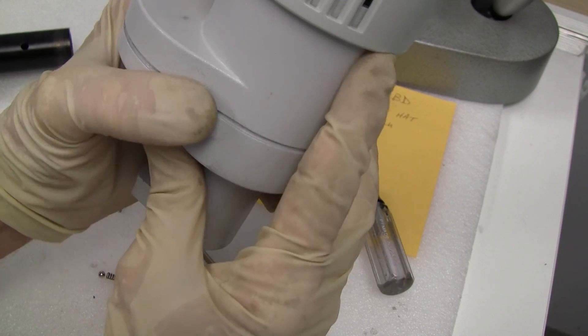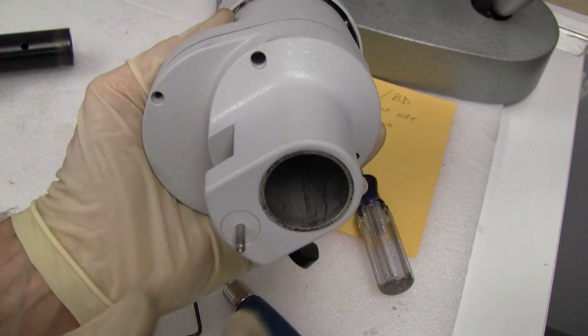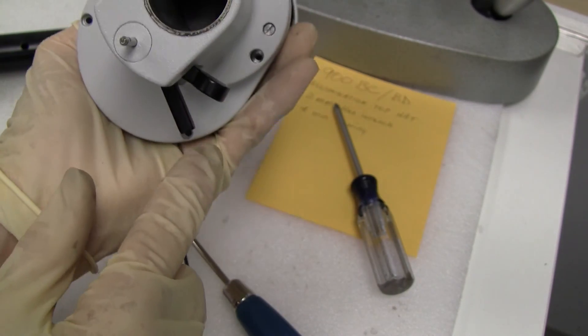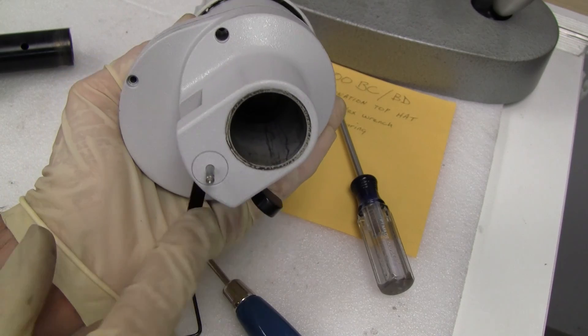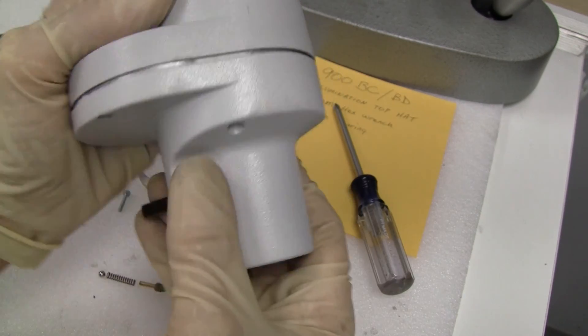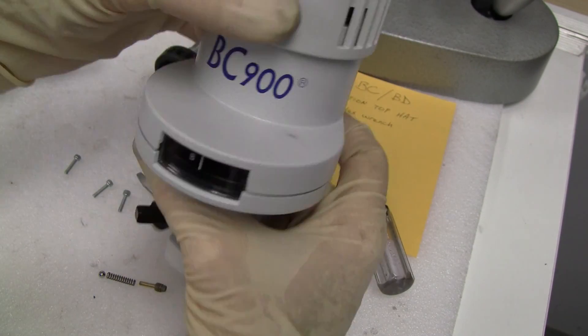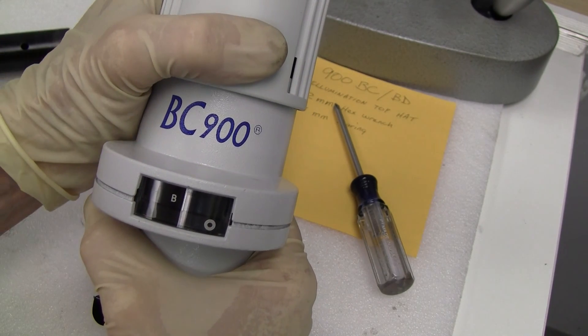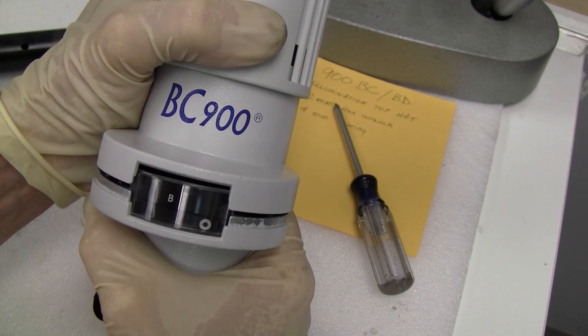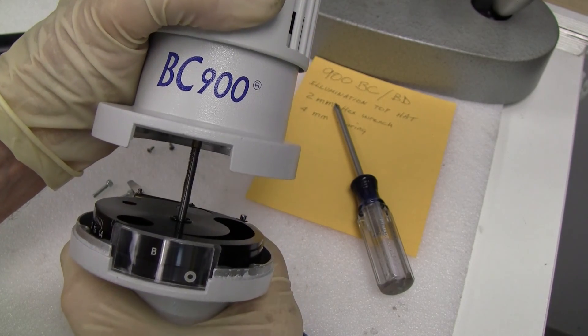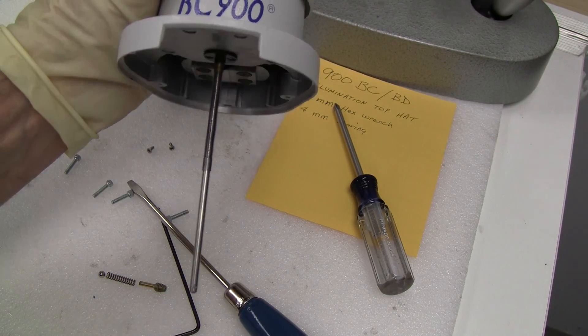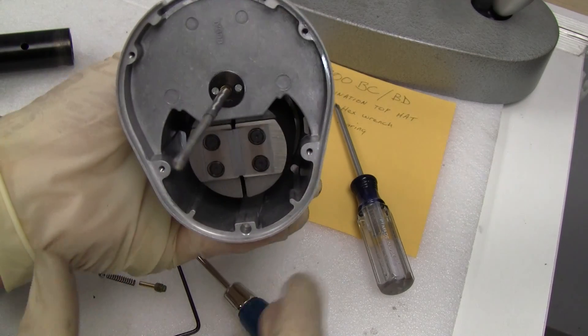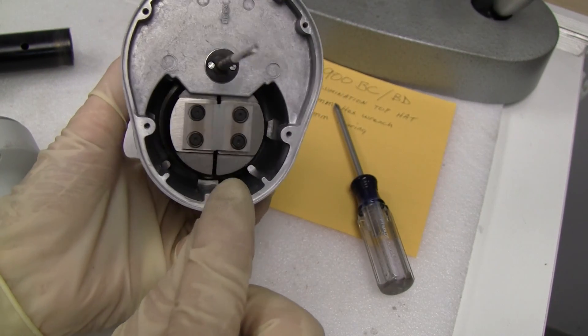Once you take that off and you've taken off your four screws, you can take your top hat off slowly which exposes your slits.